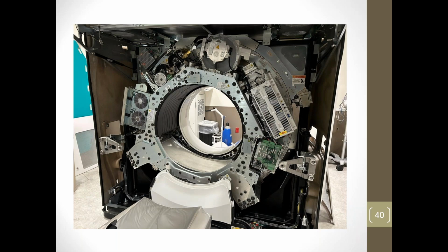A lot of people assume that the reason they have such a big bore on these machines is for patients that are extra size or extra large, and that's actually not the case. They actually have a big bore because the gantry on this can tilt forward and backwards. And if you have too small of a bore, you'll be smacking the patient in the head, or you'll be smacking them down on their knees when you tilt to get these angles.